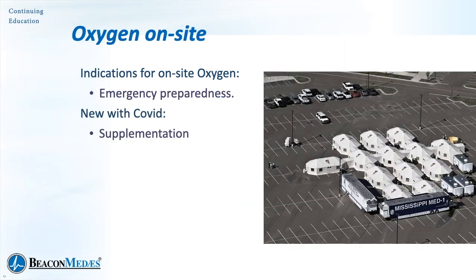And of course, nowadays we're very aware of this one, but we've been for a while, because these mobile hospitals, the Mississippi Med is shown here, there's one here in the Carolinas, they're all over the country, and they are all about emergency preparedness, a hurricane, tornado, etc. And now with COVID, we have to concern ourselves with, do we have enough oxygen? Is it a good idea to have a concentrator in the facility in order to supplement our supply?